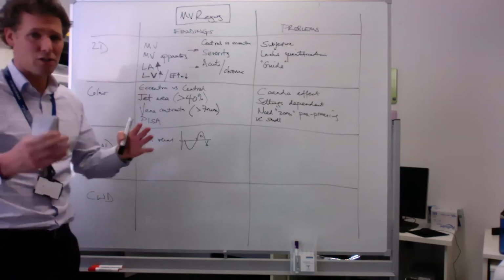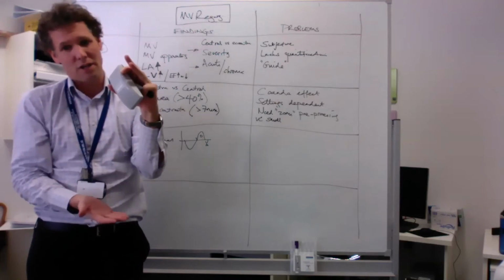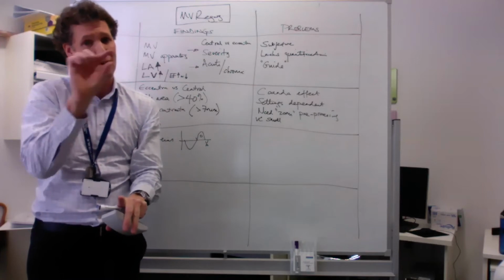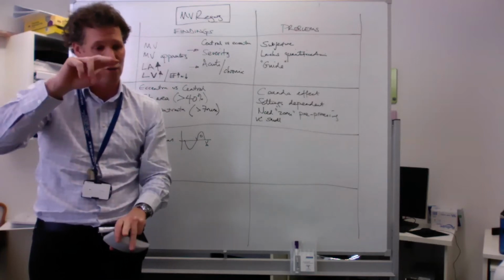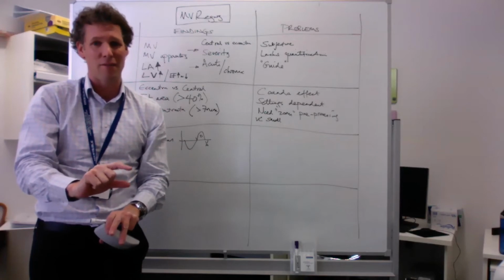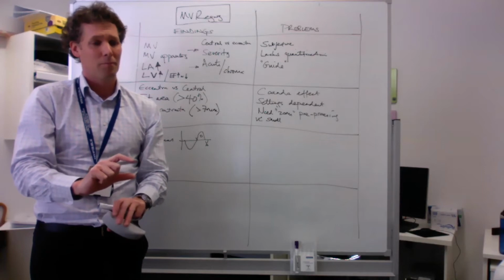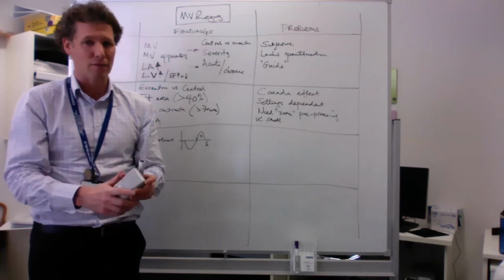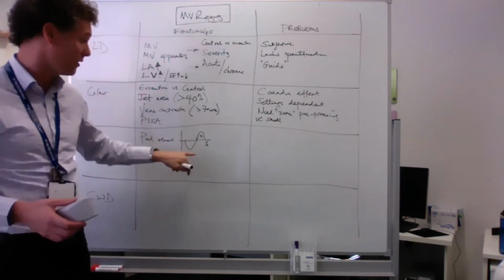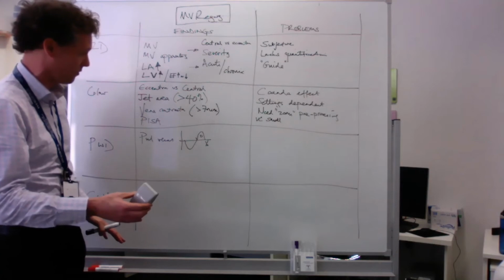The way I do it is you try and narrow your sector width down as much as you can, and get your depth exactly right. You've got to be careful about aliasing, so watch out for the ghosts on either side of your pulse wave Doppler gate. I sometimes make the gate about 5 to 7 millimeters, a little bit bigger than normal, but keeping it as small as you can. Breath holding is sometimes useful. It can really help with assessing severity of mitral regurg.